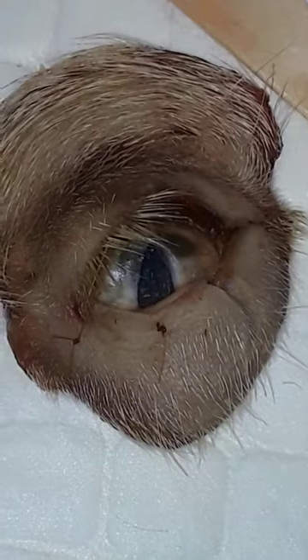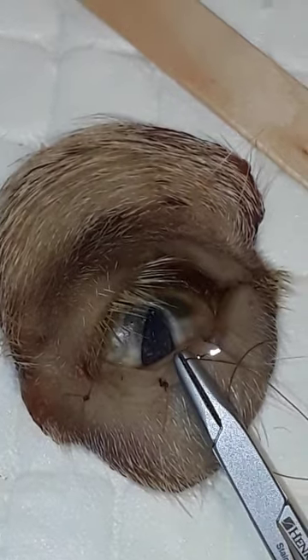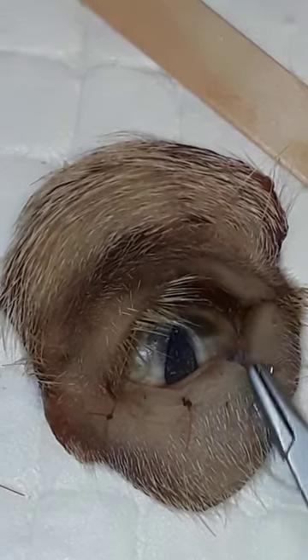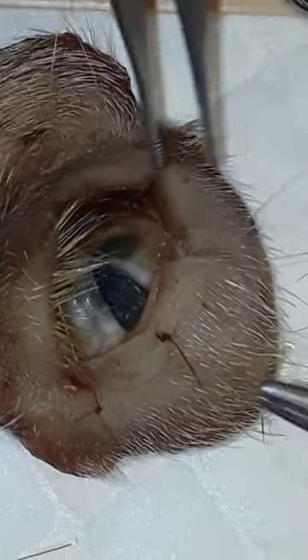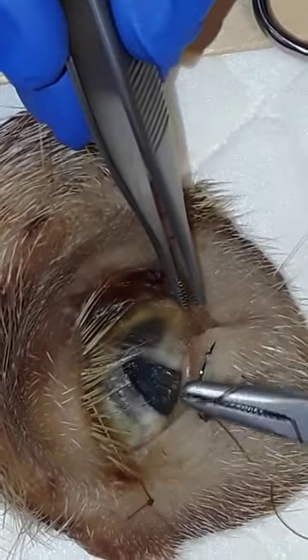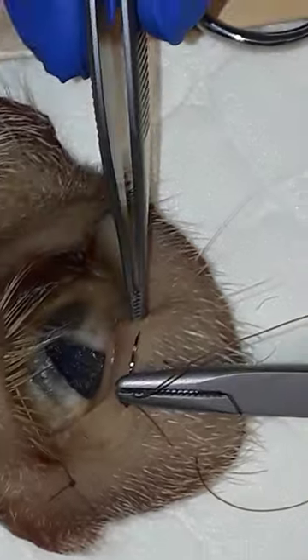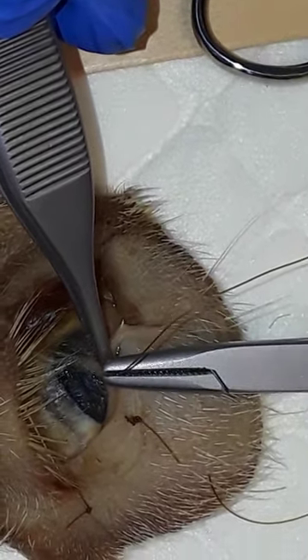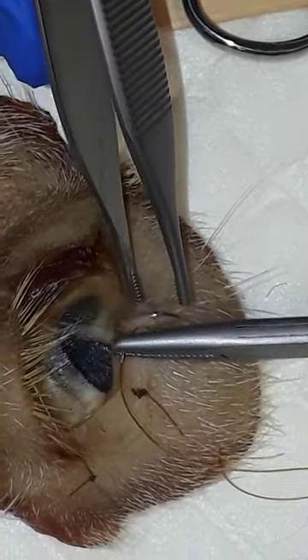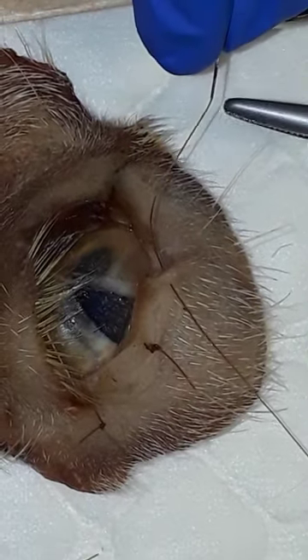This is where we start with our figure-of-eight. I'm left-handed so I'm going to start on the left side of the incision; if you're right-handed you'll probably want to start on the right side, and we have right-handed surgeons to assist you as well. So I have my wedge and I want to make my figure-of-eight suture at the lid margin first. I'm going to start just a few millimeters from the eyelid margin and take a bite from the skin into the defect, just like a simple interrupted, only half thickness through that eyelid.